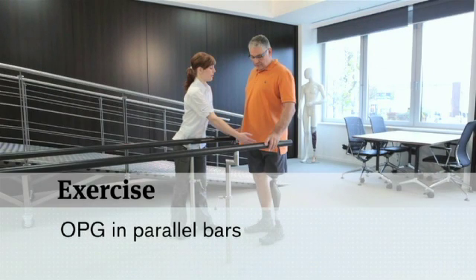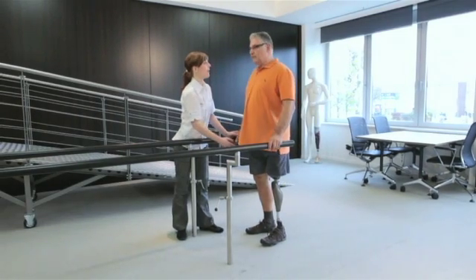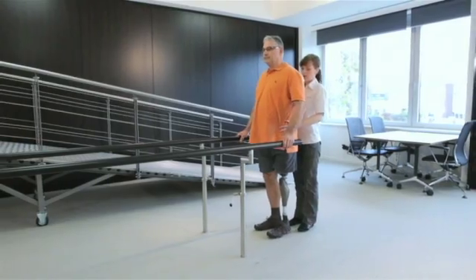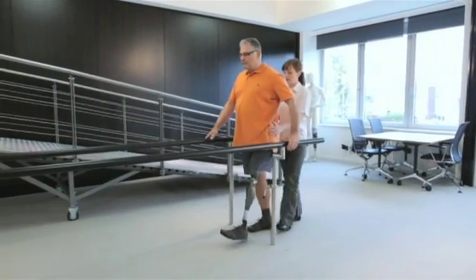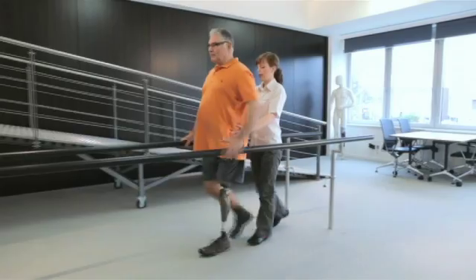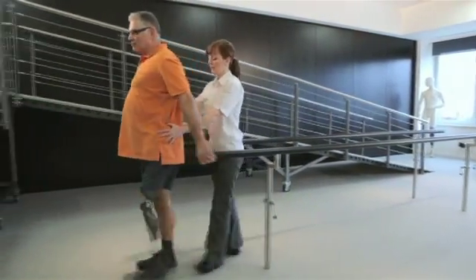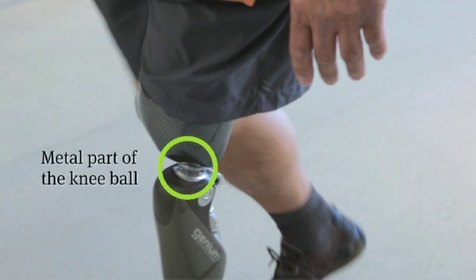As a third exercise, have the user walk with the support of the parallel bars. Be aware of natural pelvic rotation, equal arm swing, and continuous use of the OPG function. During training, it's possible to see if the user is walking optimally in the way you have taught them by watching the front of the Genium knee during heel strike.